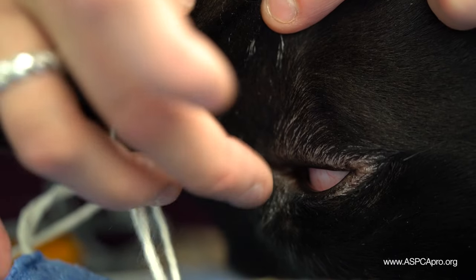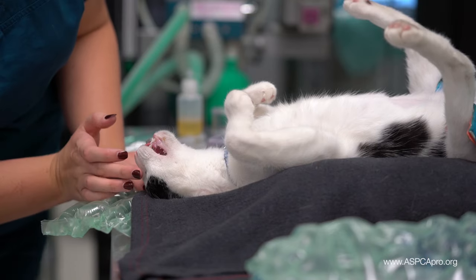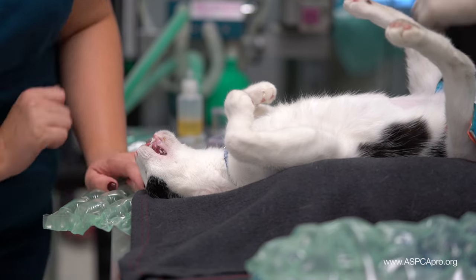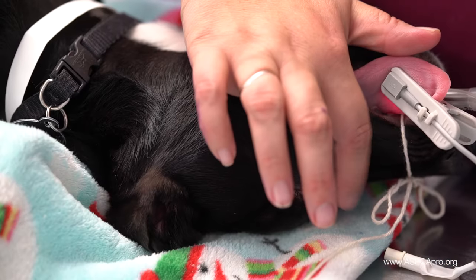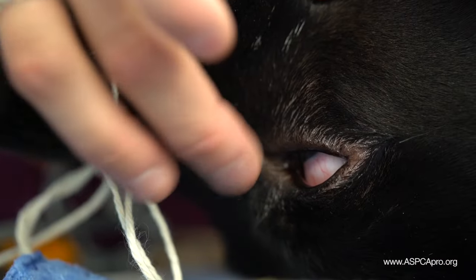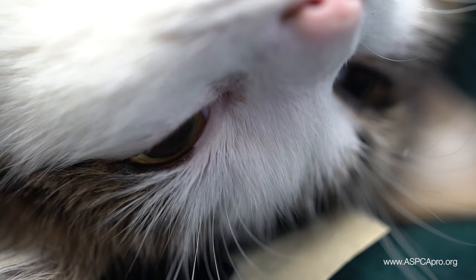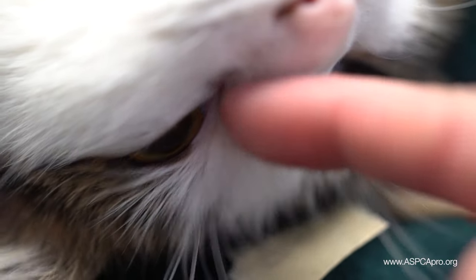If a blink response is present, the patient may be too light in anesthetic plane for the surgical process and this should be conveyed to the doctor. Remember to check both eyes, as a palpebral response may show up in one eye before the other as a patient gradually gets lighter under anesthesia.